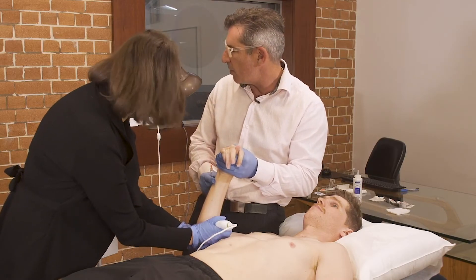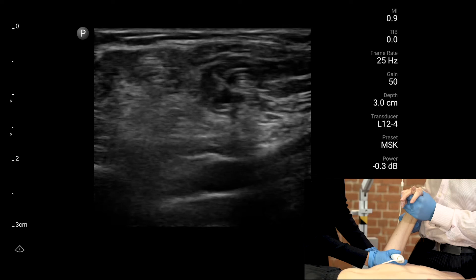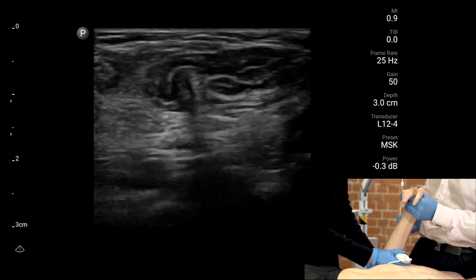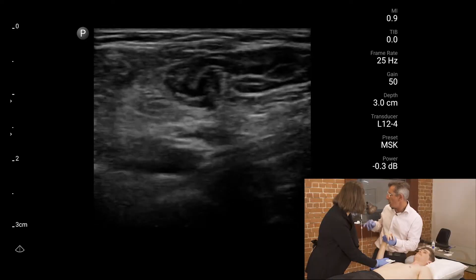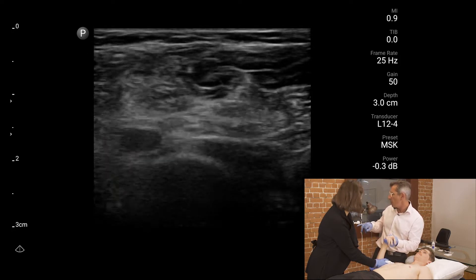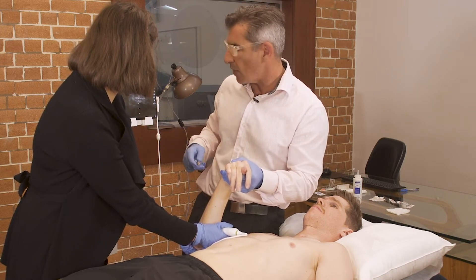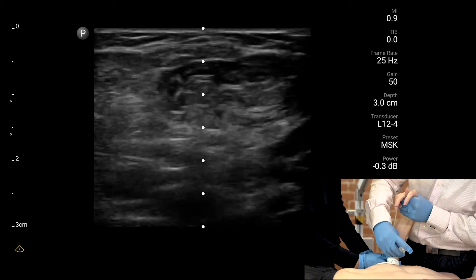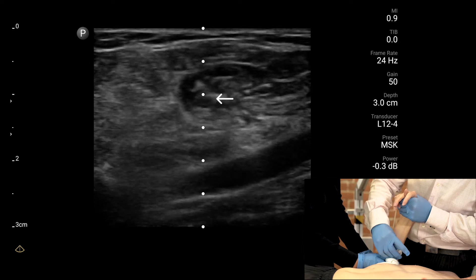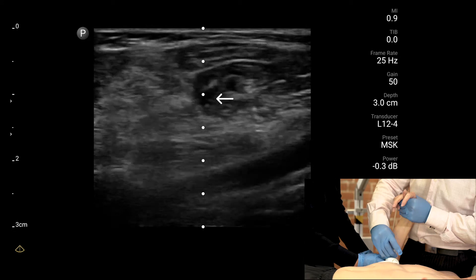I'm going to try and demonstrate the movement in the muscle now. This is yet another advantage of ultrasound — it's dynamic. You can move the hand or the wrist and you can see the dynamic movement in the muscle, and I can ensure I'm in the right place. If I wish to, I can use a guide to indicate where the centre of the probe is and run my needle down in line with the little mark on the probe. That should appear in the centre line, and you'll see the fluid running in.